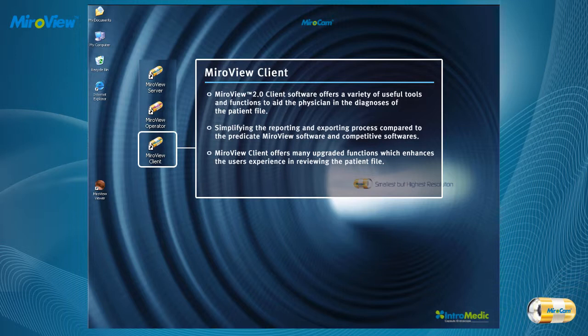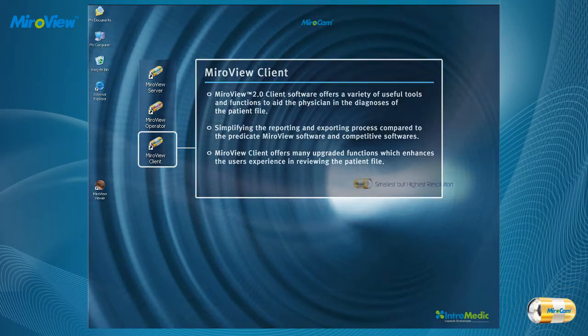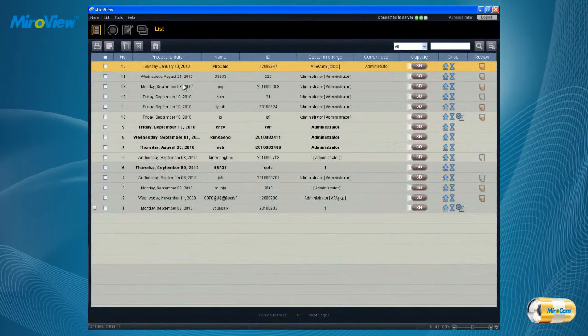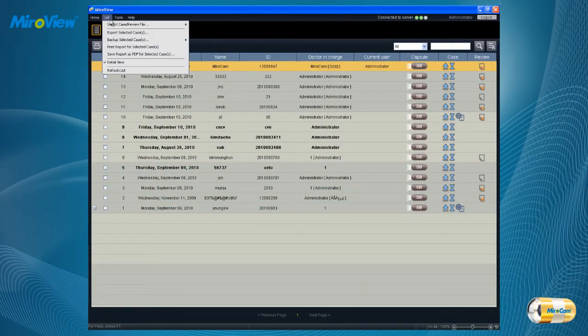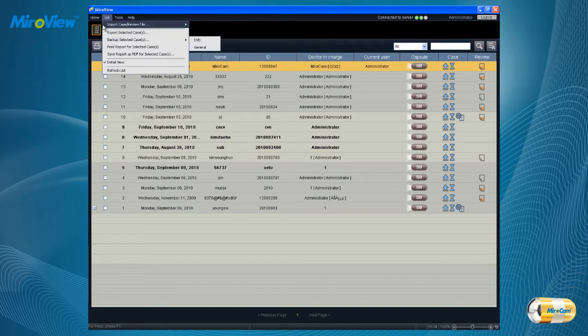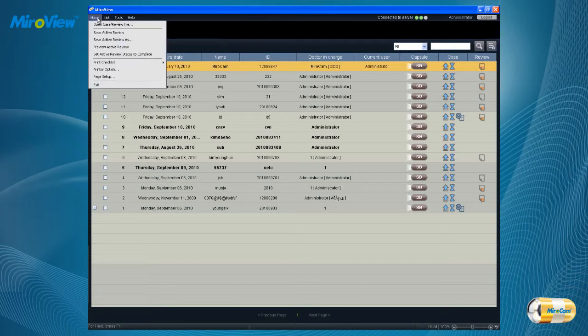MiroView Client offers many upgraded functions which enhance the user's experience in reviewing the patient file. To diagnose the patient file, log on to MiroView Client and the user will be taken to the list mode where the list of patients will be sorted in a pre-selected order.